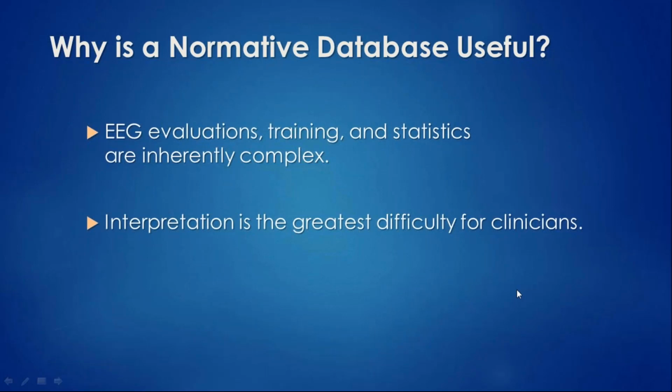Interpretation is probably the greatest difficulty for clinicians because although there's a lot of good clinical references out there, and there's also excellent published work, it's hard to amass that together into a coherent knowledge base. It takes time, it takes a lot of study, and the likelihood is you are going to see many different clients with vastly different clinical cases, and you have to be able to know the subtle differences in terms of the brainwave frequencies and patterns you might see for these different conditions.